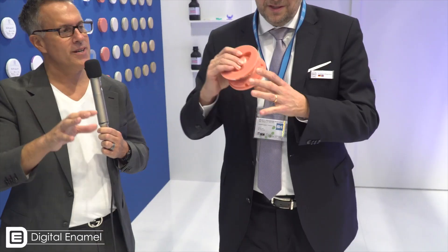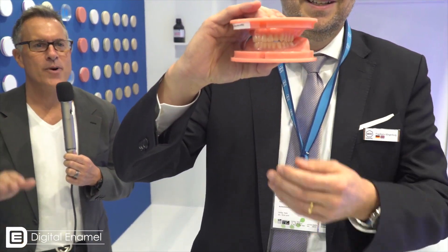The difference in our system compared to the others is very easy. We already have the teeth inside. Can you show that to the camera? Can you show what the puck looks like? Take them apart and show them separately.